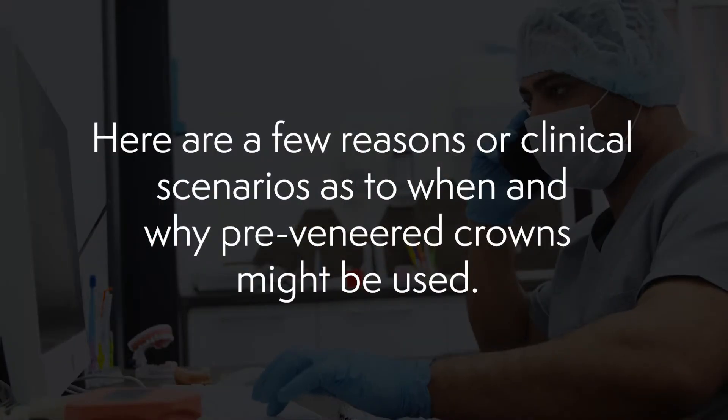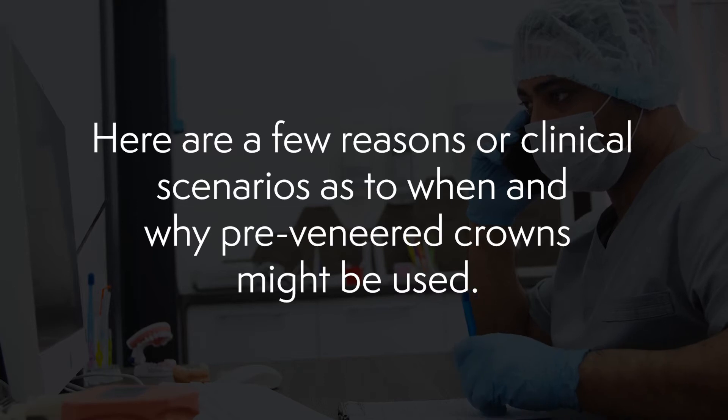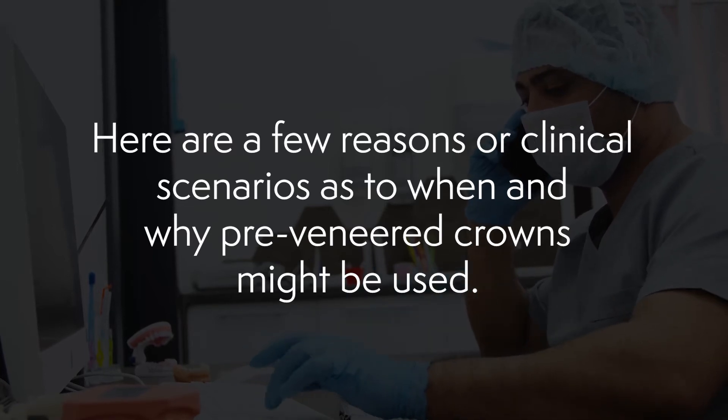A little over 10 years ago, primary zirconia crowns were introduced as a durable, very aesthetic, all-white primary anterior restoration. As good as the aesthetics and durability of the signature pre-veneered crowns are, the zirconia crowns are even better, in my opinion. But there is still a very high usage of signature pre-veneered crowns across the world.